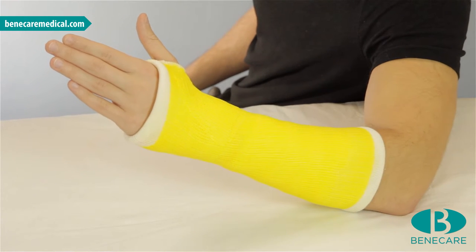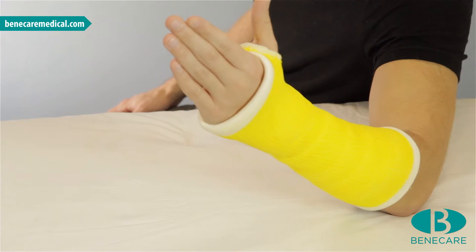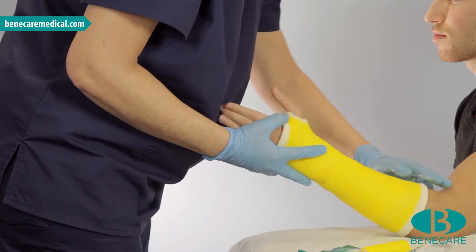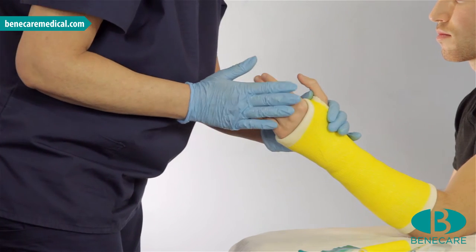Today, I am going to apply a conventional synthetic below elbow cast. This type of cast is suitable for all indications in and around the wrist. This would include fractures, trauma, orthopaedic conditions and soft tissue injuries.